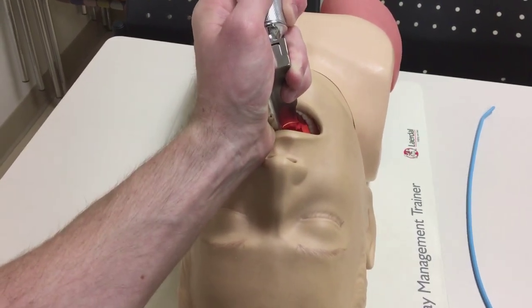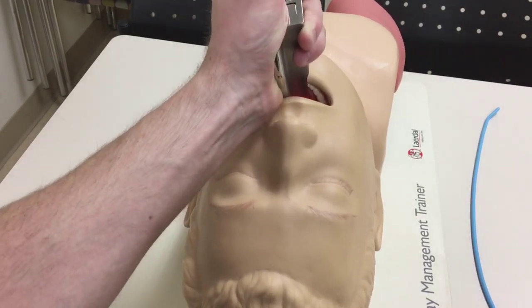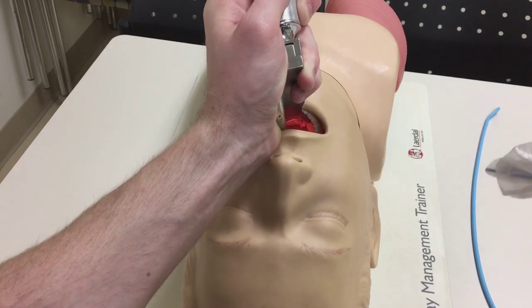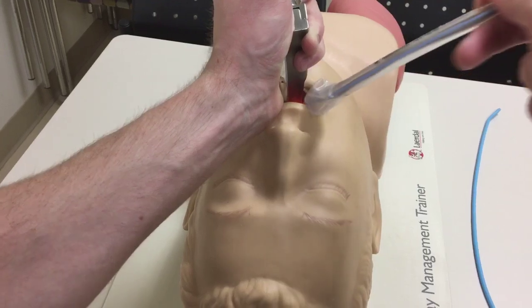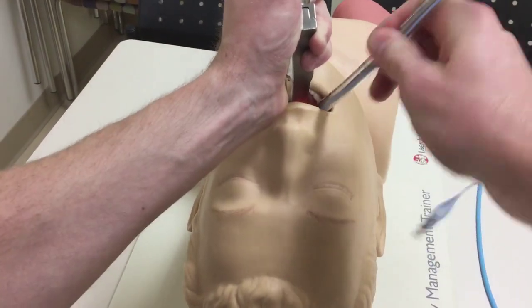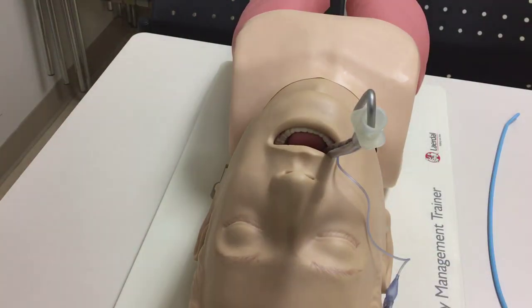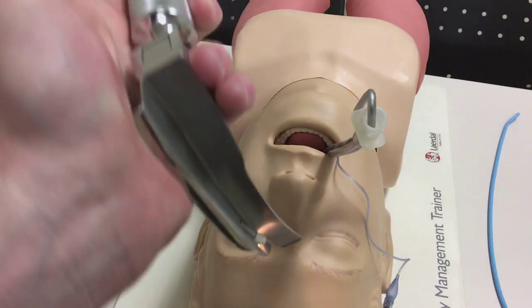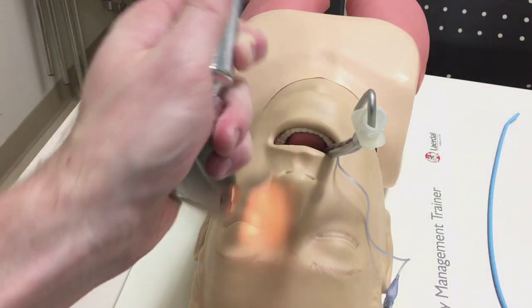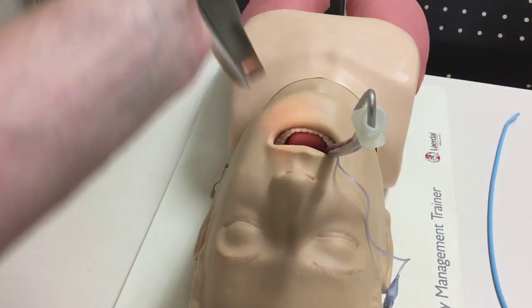When you lift the tongue, you'll get a good clear view of the cords. Come in from the side — not straight on — rotating the tube in, and they're intubated. Very simple. This is a non-difficult airway, no backup devices, just a standard Mac 4. Sweep the tongue: in and sweep, not straight in and pull. Sweeping it out of your way.